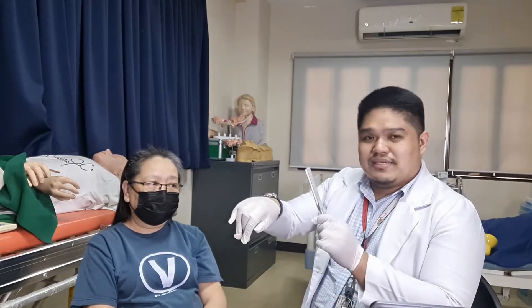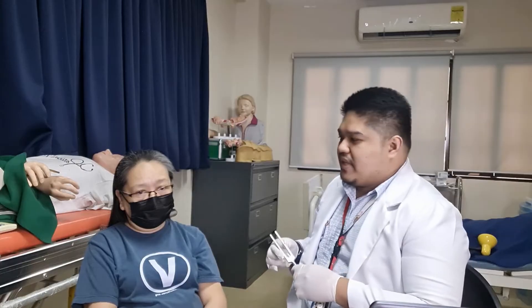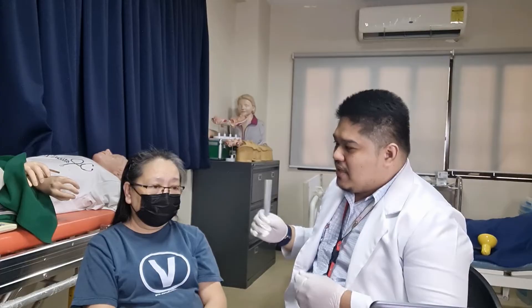At this point I am going to utilize the tuning fork for the assessment of the Weber and Rinne tests. These are necessary for the assessment of sensorineural hearing loss. For the Weber test, it is necessary to assess the lateralization of sounds — it assesses whether there is equal sound on the left and right ears. You activate the tuning fork by tapping the back of your hand or by pinching it between your index finger and thumb. I will place the tuning fork on the top of your forehead — tell me if one side sounds louder.